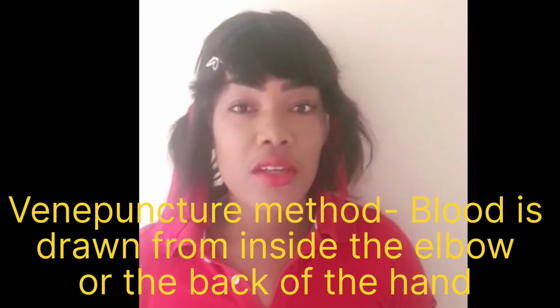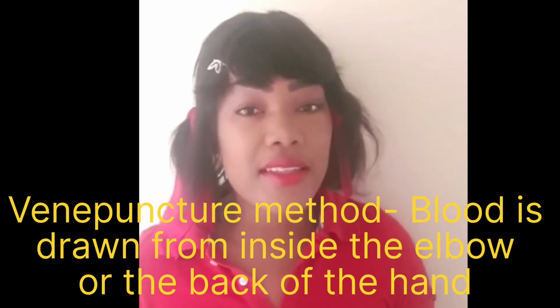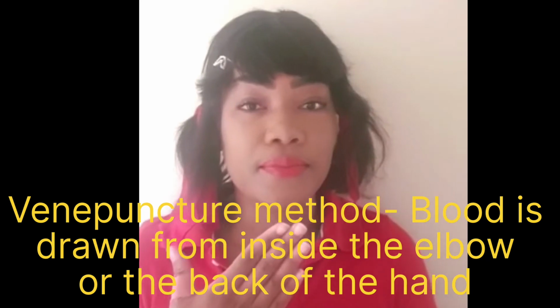An explanation of how the test is done. The venipuncture method: blood is collected from a vein inside the elbow or the back of the hand.